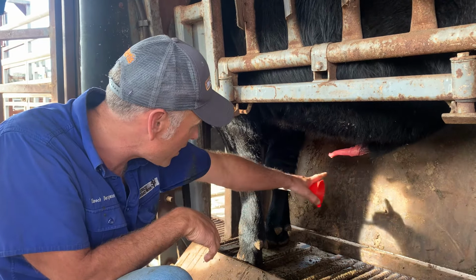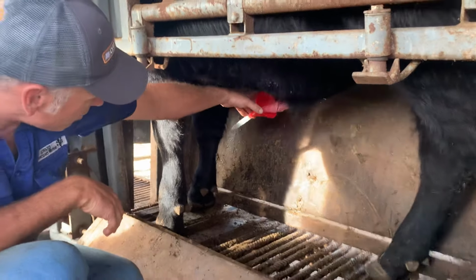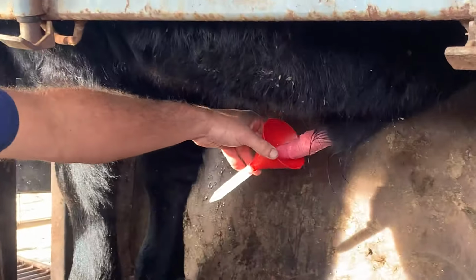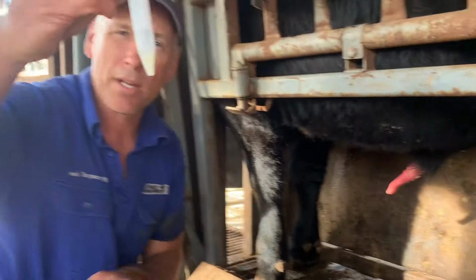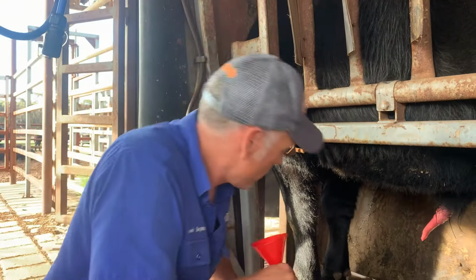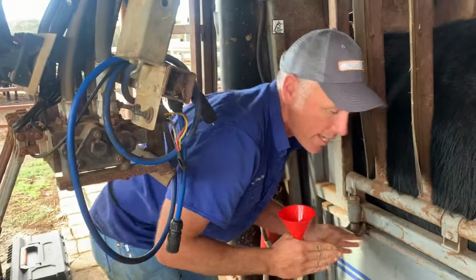So that was pre-ejaculate. Now we're into the good stuff. So there's the baby batter, the good stuff. We collect a bit of that, and then we just hit reset on this. So we look at that. That's probably going to be a concentration of about 4. Depends how you want your coffee. We'll call that a 4.